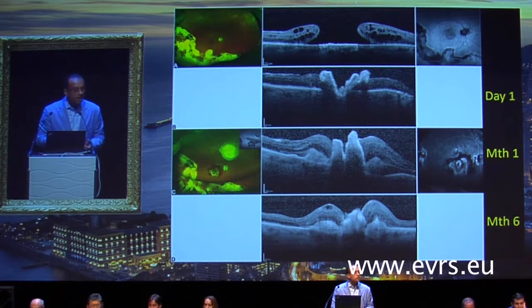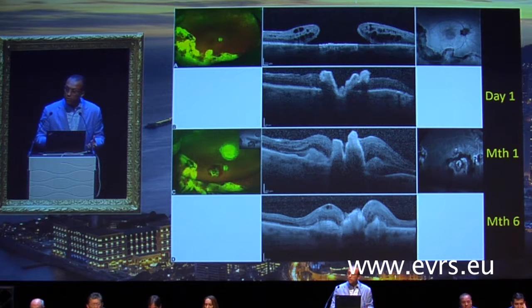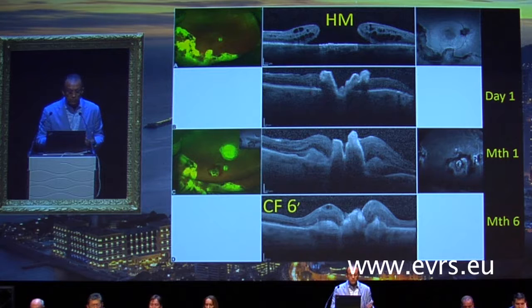So look at what happened to him gradually. The choroid is initially at day 1 blocking the hole, and then what is happening to the surrounding retina? You see gradual integration of the choroid into the underlying choroid becoming 1 layer, and then what is happening to the adjacent retina in that 1,500 hole? Look at what's happening to that edge, heaping and going in to try to close that area of the hole. And he was solid hand motion at this, so at 6 months, he's clearly count fingers at 6 feet, and this is someone that is very advanced.